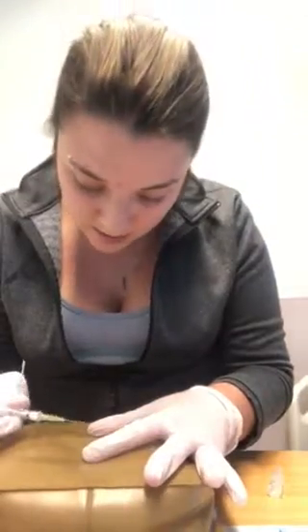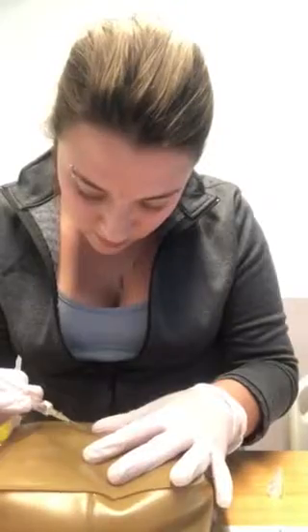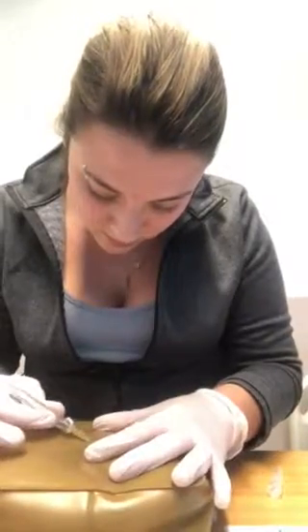Okay, and I'm going to come in with my needle. I'm going to have the bevel up, and I'm going to come in at a 45-degree angle into the tissue. I'm going to pinch an inch and dart in. Okay, so at this point I am where I need to be. I'm going to vanish my needle, and I'm going to secure my catheter here.